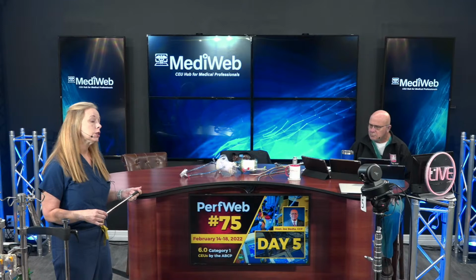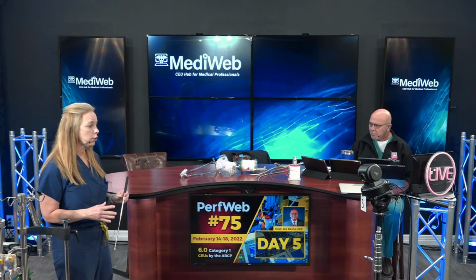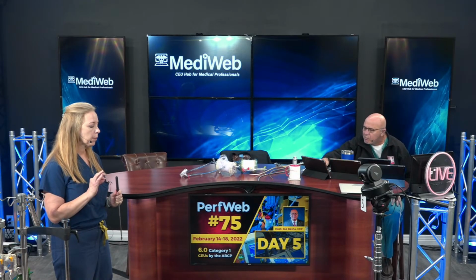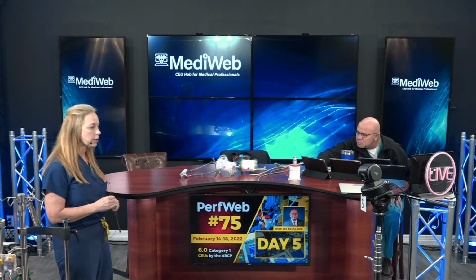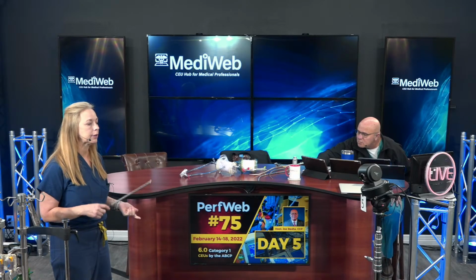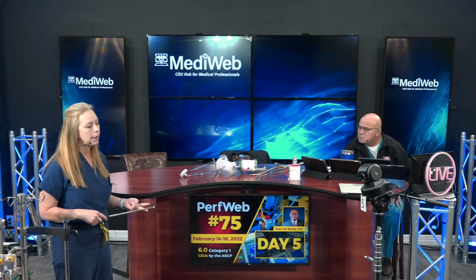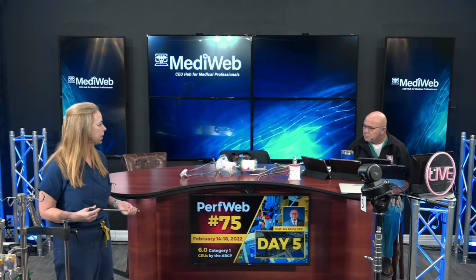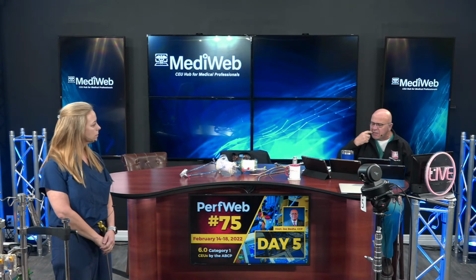It's something to talk to your bedside nurse about, because they're often in the room more than you are. If you teach them that little place to keep an eye on, they can often be your partner in helping to recognize that problem before it becomes serious. Now you have time to get albumin or draw a lab, or maybe I'd rather give blood. You would have some time to prepare for that situation. Absolutely. Very excellent. Very good.